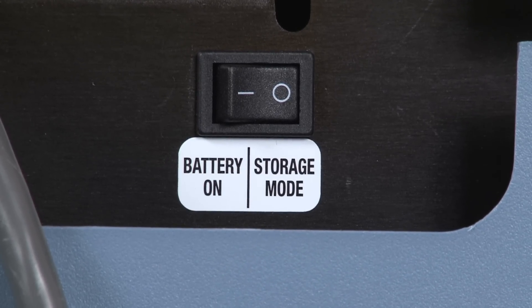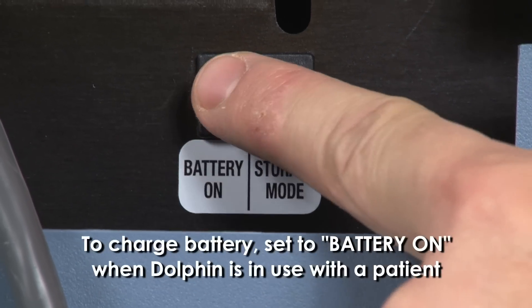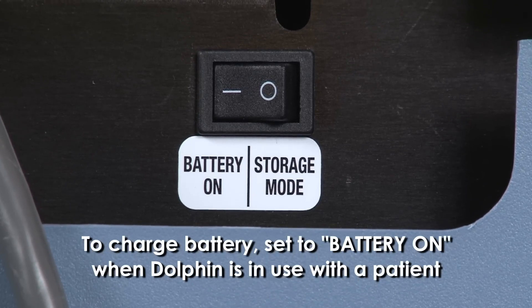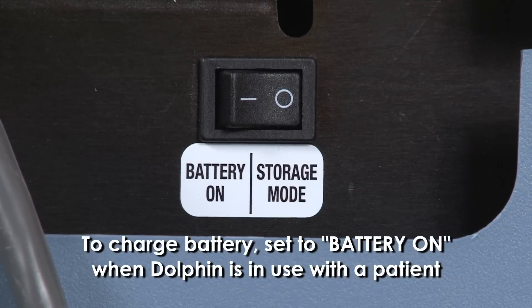Located on the underside of the control unit is a battery disconnect button. Whenever the Dolphin is being utilized with a patient, the switch should be set to battery. If set to storage mode, the battery will not charge.